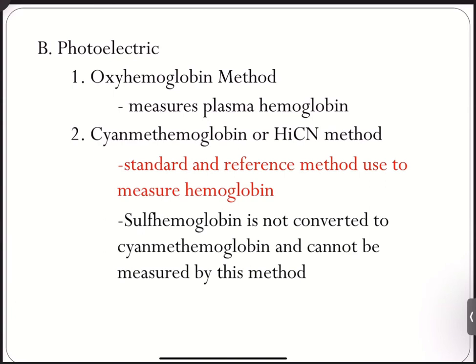While your direct methods use comparators, which cannot distinguish your hemoglobins.